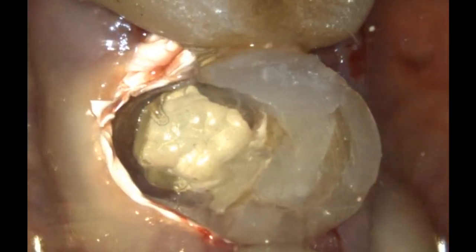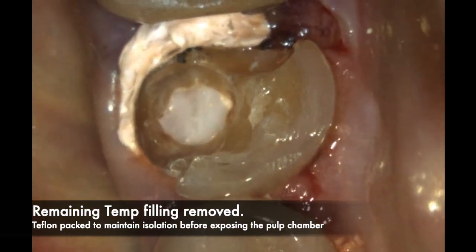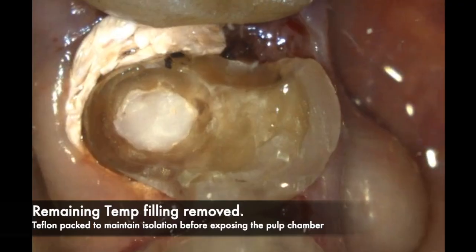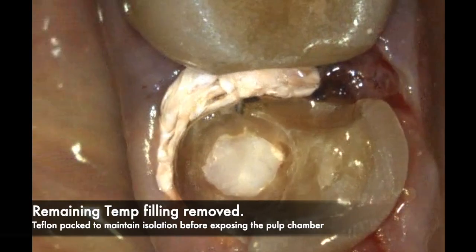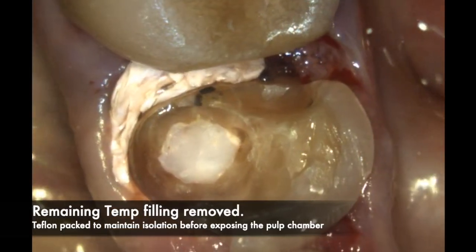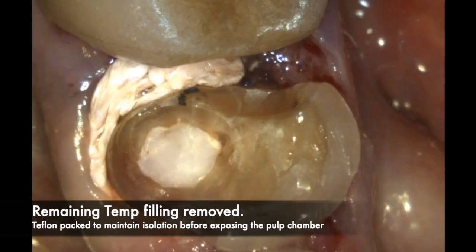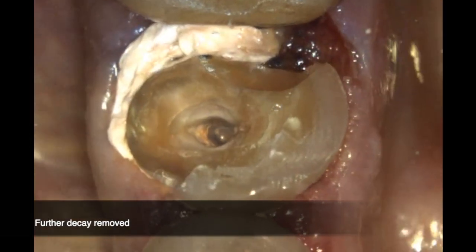The next step is to continue removing the old restorative material along with the temporary filling until you reach solid dentin. Ensure that all decay is clean and all the old restorative material is completely cleaned out before you start your buildup process — that is very, very important.